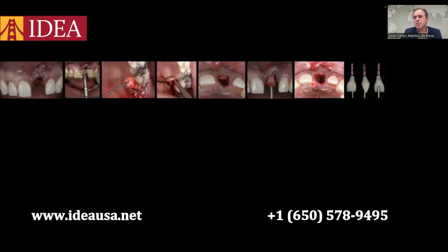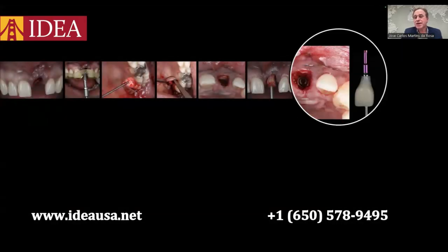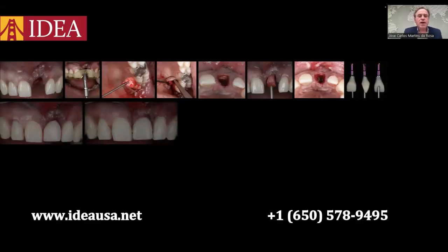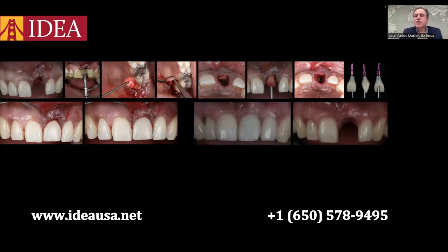After we finish the reconstruction, you see here that we did the bone and soft tissue reconstruction plus immediate provision plus implant installation. And you see here that we construct the provisional restoration with ideal emergence profile, and we install this provisional restoration over the implant. The primary stability should be at least 30 Newton centimeter in order to allow us to perform our provisional restoration immediately. We perform the final suture, and you see the outcome after a couple of months.